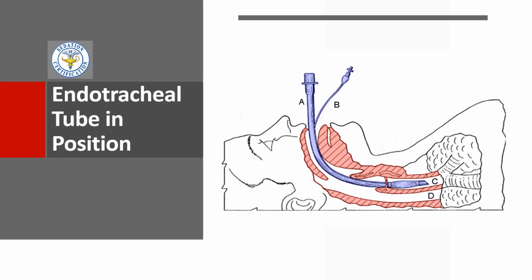That's what they look like just past the vocal cords. Don't go any further than that. So let's look at how this works.